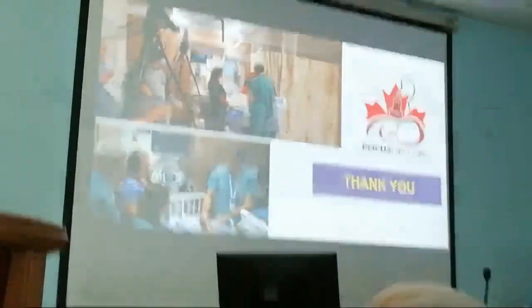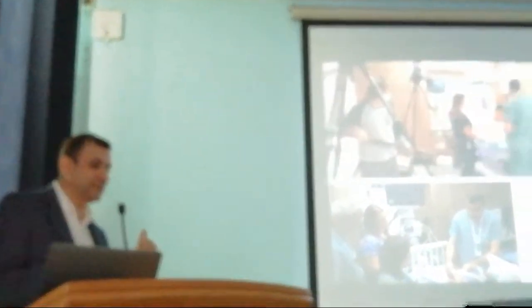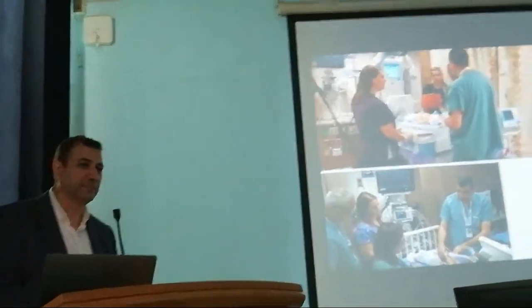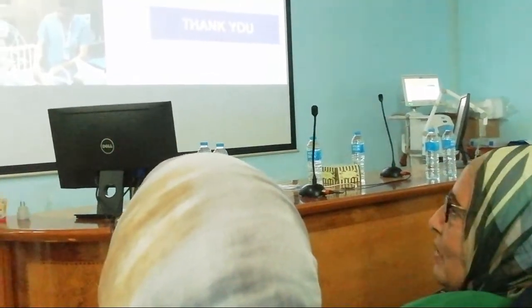So what's your worry about 30? Maybe a leak? Yes. So in this case, يعني ما اعتقدش، احنا ساعات فعلا بنرفع بيك، بس ممكن في الهايبر بس في الكونفشنال ventilation يوصل 8 9 حتى ساعات sometimes واحنا واقفين for 10 minutes then decrease the gauge.